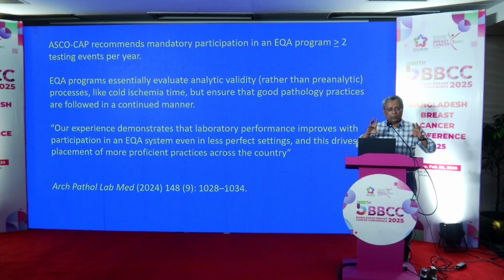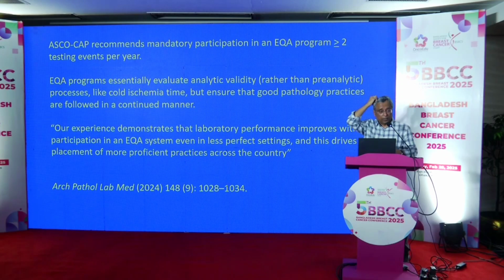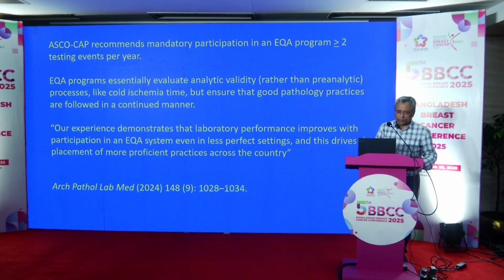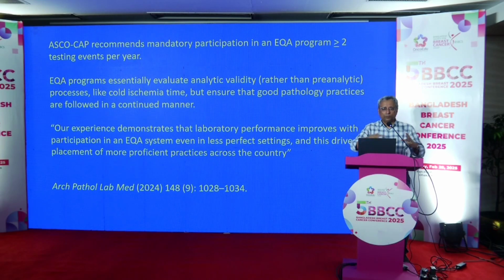So that means EQA doesn't have to be an overseas program, it could be inside the country also. So you can send your slide to another lab, ask them to send their slide to your lab. So this is how you can compare the two. And if you have more than 2 labs, 3, 4 labs, they form like a consortium, and then you can use that as your regulatory agency or something, for immunohistochemistry. And in fact, you can extend that to molecular testing.